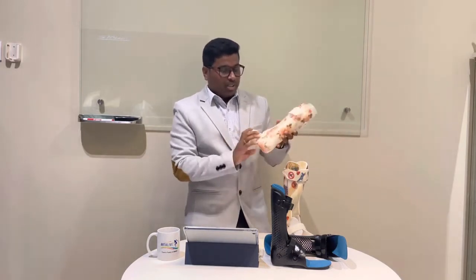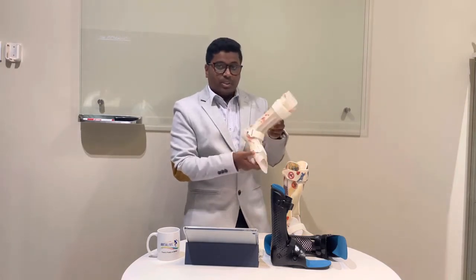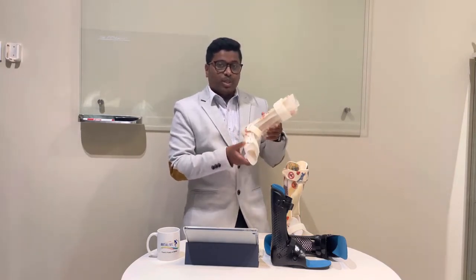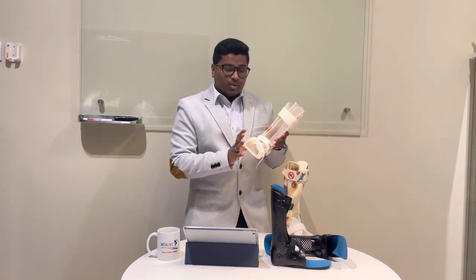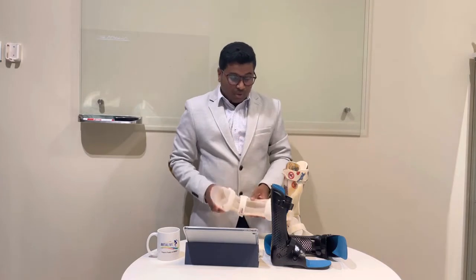This double wall AFO has a flexible inner layer and a polypropylene outer layer. Because of this construction, it is bigger and bulkier, and parents also need to find a bigger shoe size for their children.